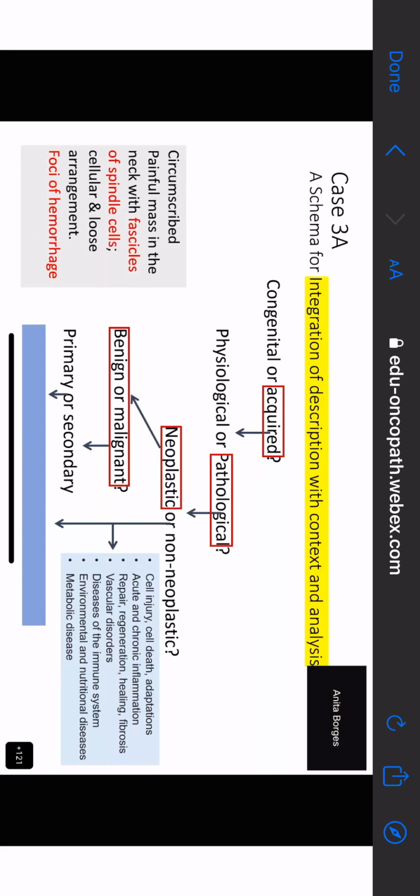You saw what all of us saw, but you came to the diagnosis of what? A vascular tumor, pericytoma. But when I described it, is my description made up, Vimi? You had the same description. Yes or no?